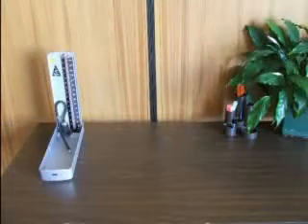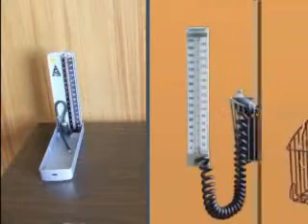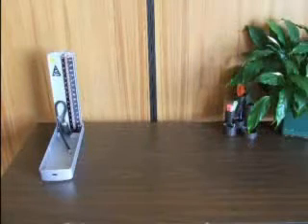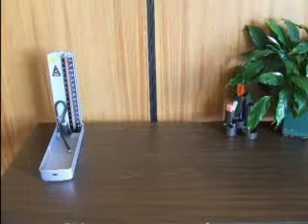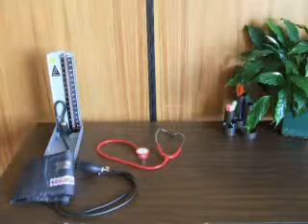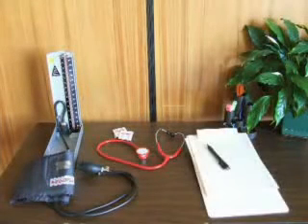The equipment required for this procedure is a sphygmomanometer. This may be an aneroid, a mercury type, or an electronic version. The measurements from either are recorded as millimetres of mercury. A blood pressure cuff — this is an inflatable rubber bladder inside a cloth cover. A stethoscope. Alcohol swabs. And a pen and paper to record the measurement.